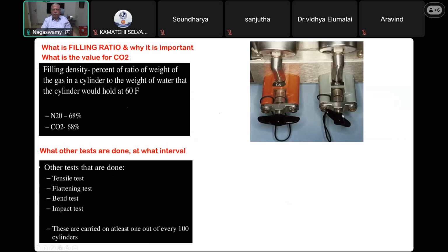Now you see another picture where, in the hanger yoke assembly, instead of the cylinder, there is something fitted here. What is that? This is the hanger yoke assembly which we have been talking about all this time. Instead of a cylinder, there is something else fitted into it, and this is the retaining screw which has been tightened here. What is this portion, and why is it being done? This is called the blank or dummy plug.